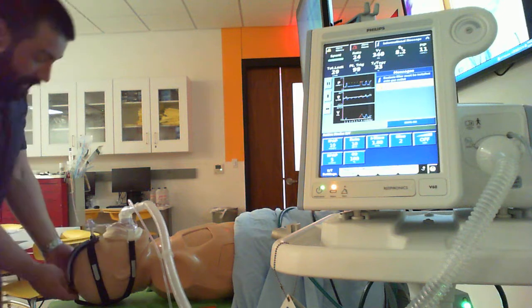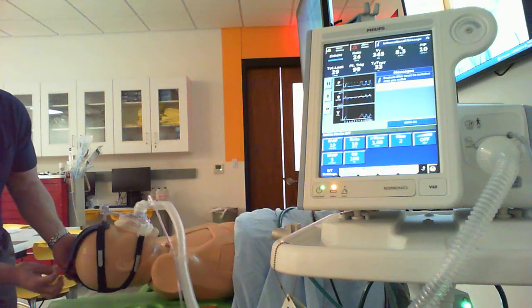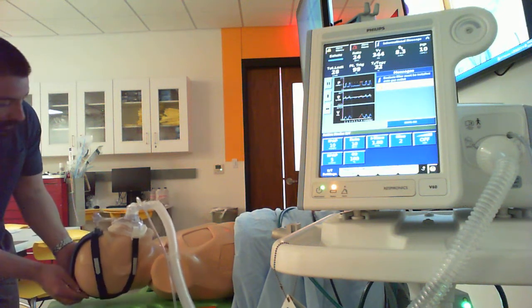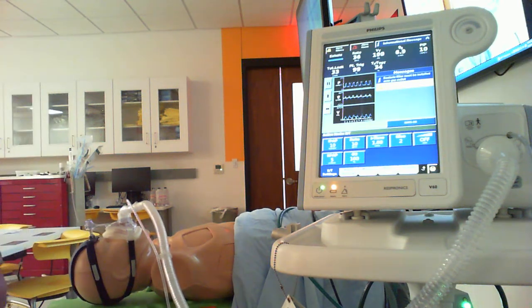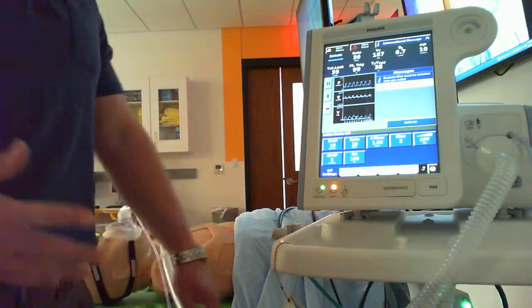So I'm going to go ahead and use this last little strap that just tightens everything up over the top part, the crown of the head. That feel okay? Not too tight or anything? All right, good deal. Okay, so let's talk about settings and bedside goals.